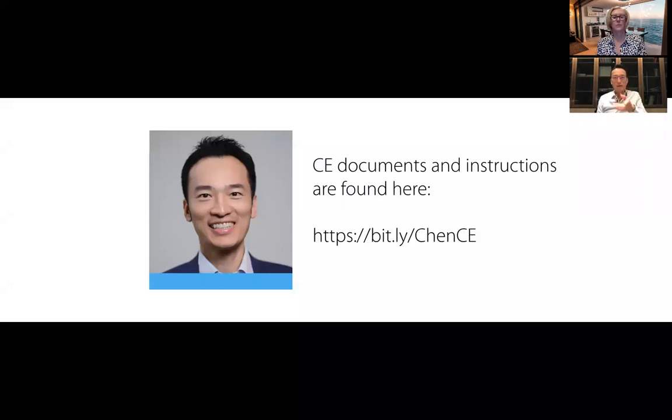Right. That's a great question, George. With the dynamic navigation system, or the Navident system in particular, it would be very nice if we could have the double scan procedure as well, because with the static guides we can do the double scan, as in one of the cases I showed. We make a radiographic guide and have the patient take the CBCT with the guide in the mouth. So on the software we can see the position of the teeth and know exactly where to place the implants. With this particular case, I wasn't able to do that.